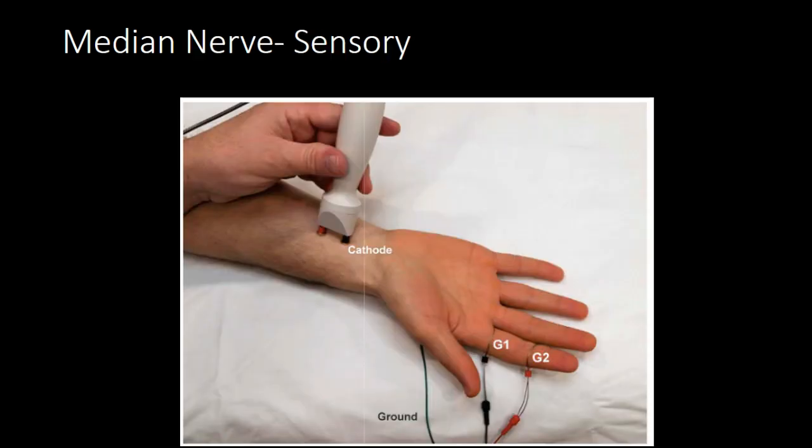Again, median nerve sensory study. G1 is your recording, G2 is your reference, ground is on the back.